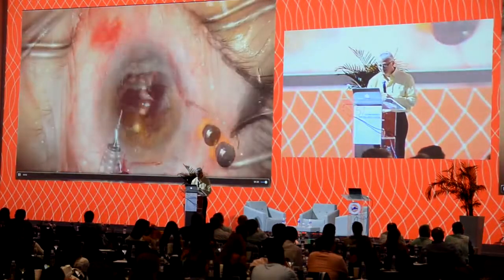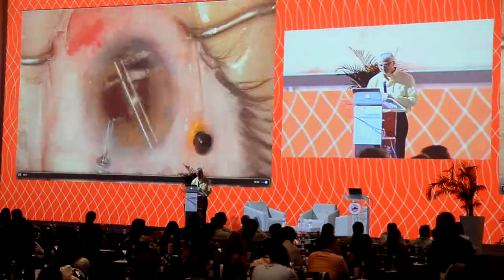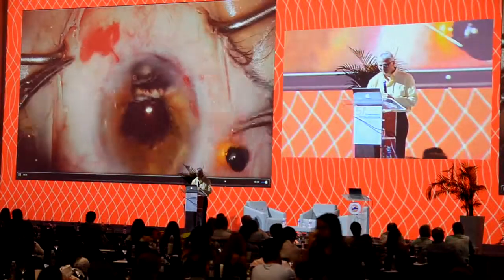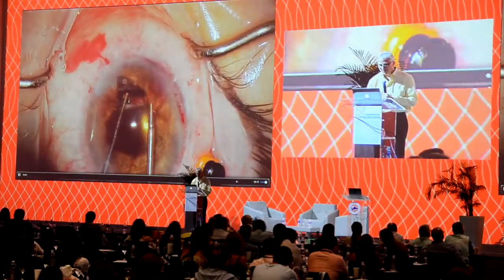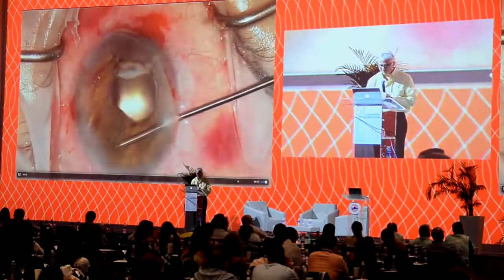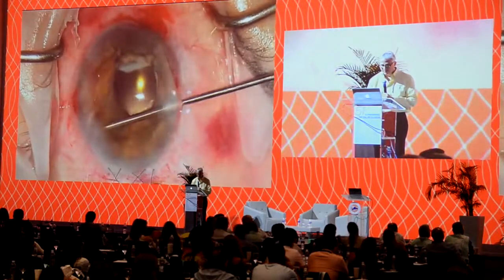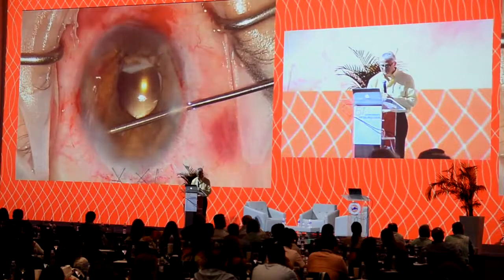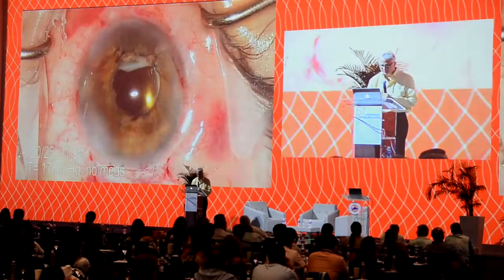Oh, isn't that nice? Except for this time. So instead, we decided to just suture to the capsule. That worked out pretty well. And in fact, every once in a while, you get lucky, and you can find that there's an extra piece of iris hiding somewhere where you didn't expect it. And we were able to suture that to the capsule using the cautery technique, kind of tying everything together in this case. We're able to reshape the pupil and center it upon the implant lens.